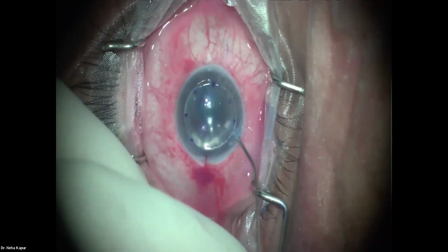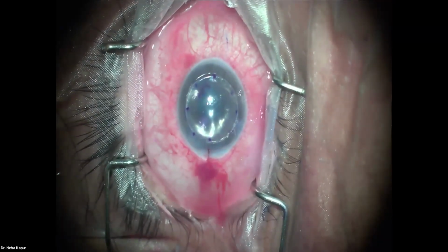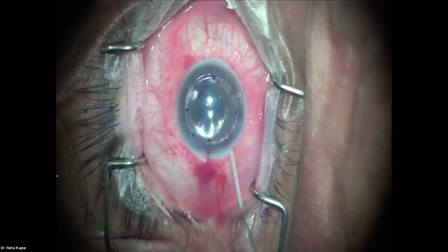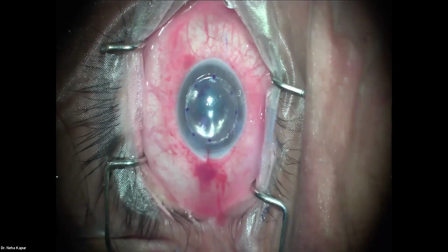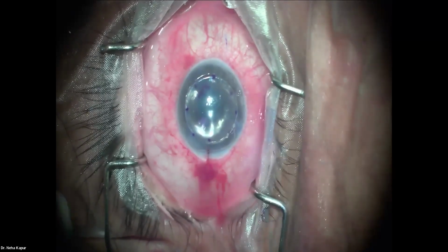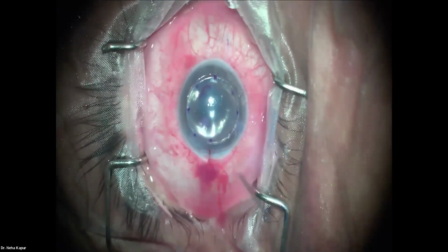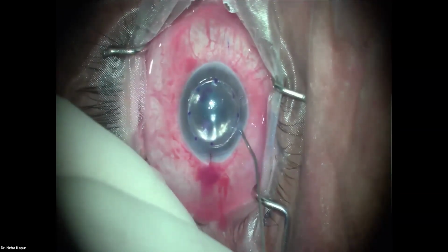But the eye is still not as tight as I'd like it to be. There's a little bit of iris adhesion here in the periphery, but it's okay. All of that can be released. First, we should have the lenticule stick in place. That is important.